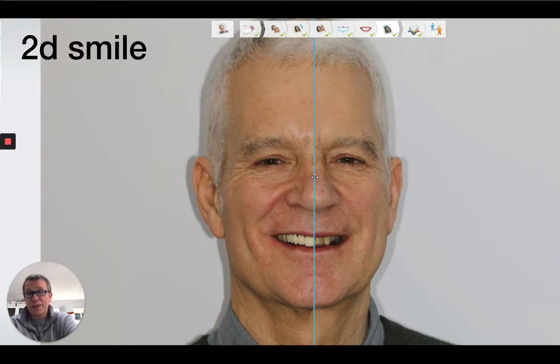And there's lots and lots of different things out there. There's Smile Designer Pro, and there are millions of ways of doing this. But I'm a 3Shape user. I love Trios, and built into my little system is this Smile Design program where we can change the shapes, change the colors, and in about 10 minutes, we could give Ray a little rendering of what this might look like, and show him, okay, Ray, what would you think if it would look something like this?